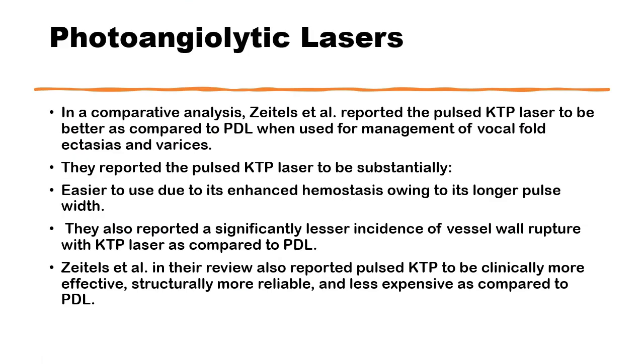In a comparative analysis of the KTP laser to pulse dye laser for the vascular anomalies of the vocal folds, Zeitels and his associates showed that the KTP laser is actually superior in that it is easier to use. It has significantly less incidence of vessel wall rupture. It has better clinical output and can also be more reliable and less expensive compared to the pulsed dye laser.